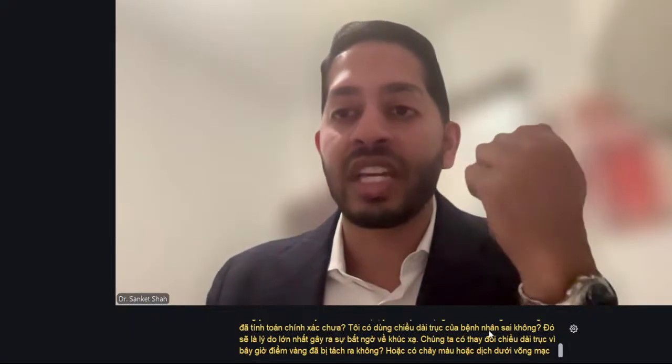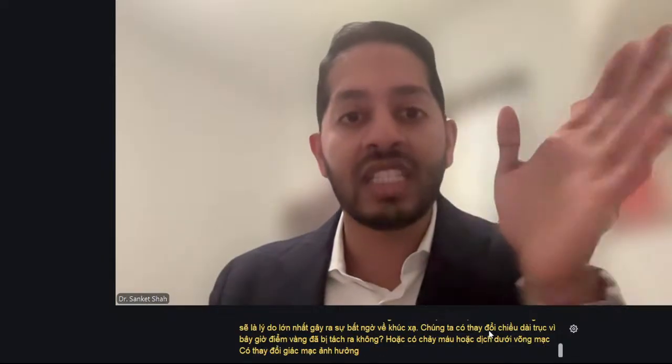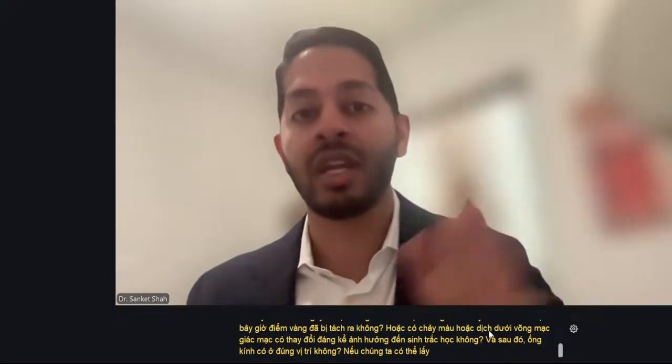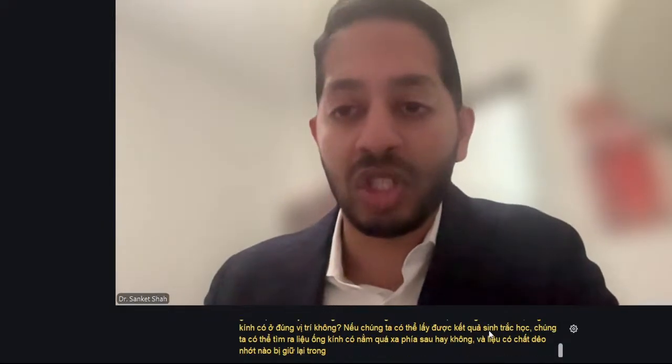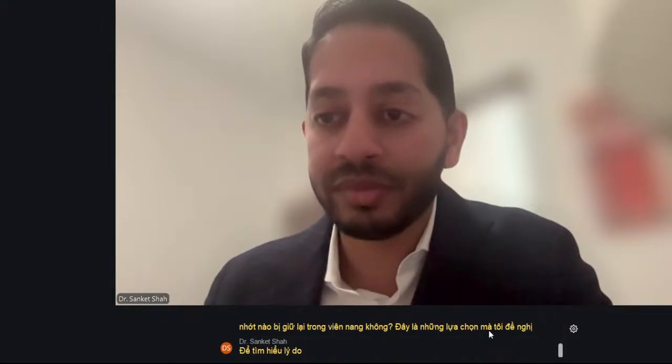Did the cornea change? That's affecting the biometry significantly. And then is the lens where it's supposed to be? If we can get the biometry, we can find out if the lens is perhaps too far back, or is there viscoelastic retained in the capsule? These are the options I would suggest for finding out why there's refractive surprise.